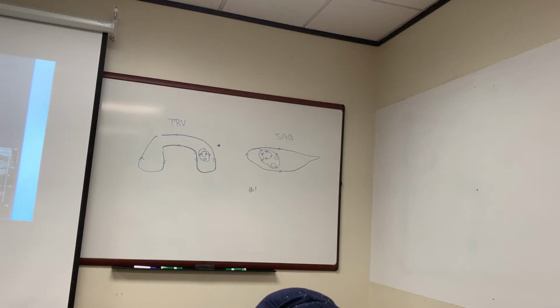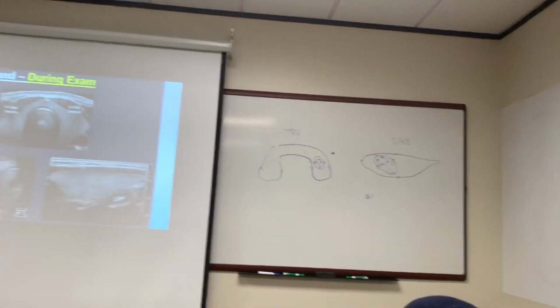What I say, a lesion, a mass lesion. You can say cyst if you're sure that's what it is, but again, I'm going to say lesion is probably the best word. The lesion kind of covers everything. So I'm just really careful about what I say.